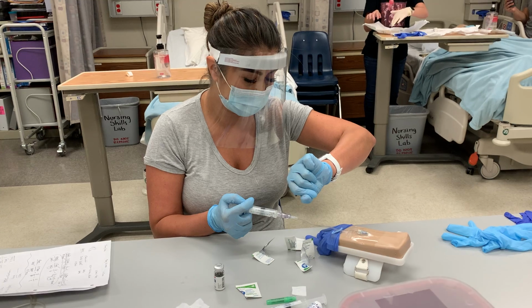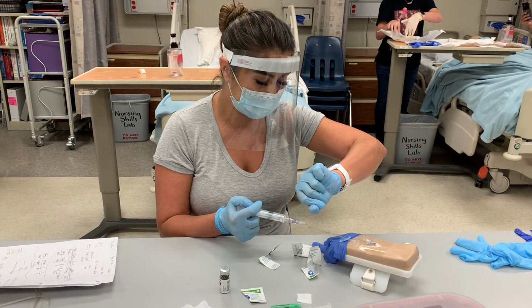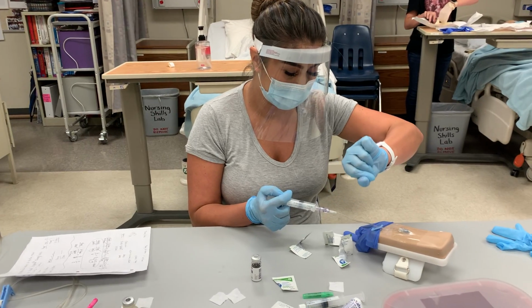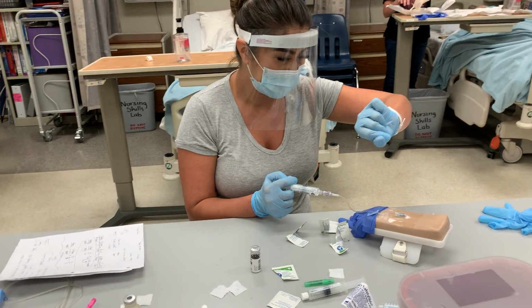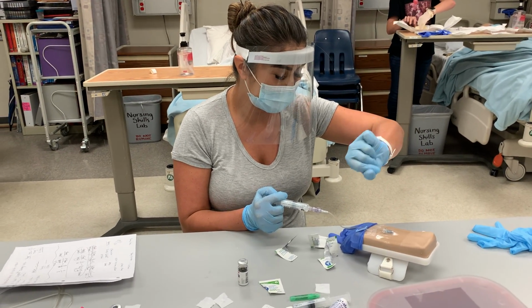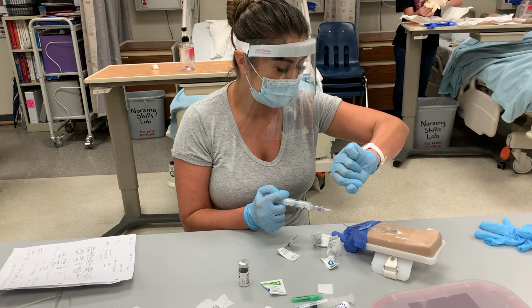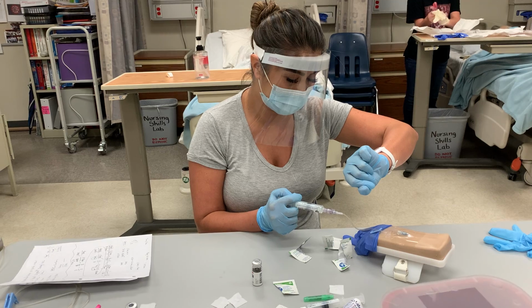Watching the patient, making sure that they're not having any reactions.